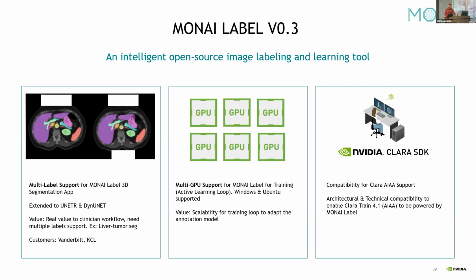I don't know. I have tons of cats and tons of dogs. I have a zoo. But whatever you want it to be, let's say it's cat tumors. You've never seen a cat tumor before, right? The model has never seen one. So you start labeling where the cat tumors are. Well, the model is going to transfer learn on your labels after you do X amount of labels, and then it will auto label for you. And then you're in the loop and you can correct it if it's wrong, and it keeps learning from your corrections until it's flawless, right? Or as close to flawless as you can get.